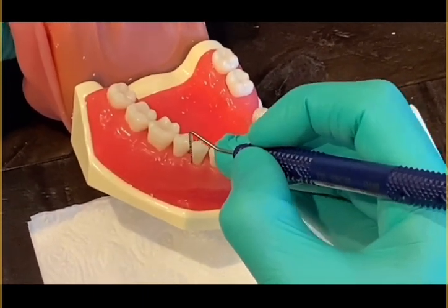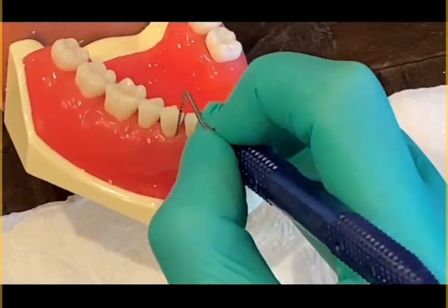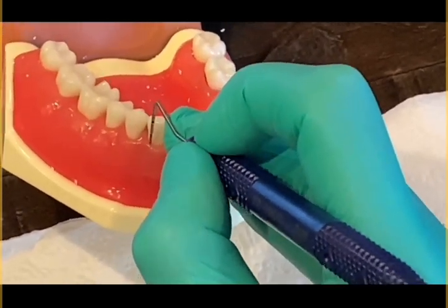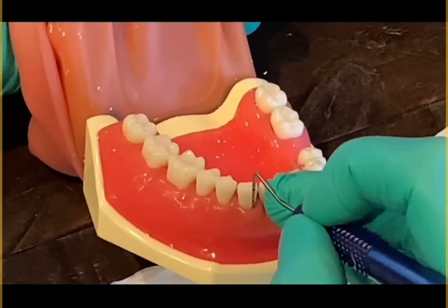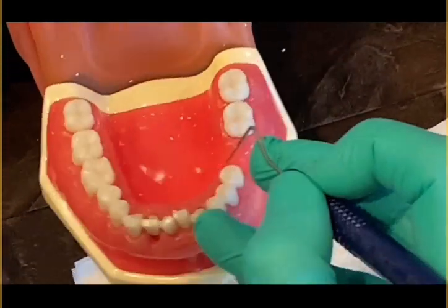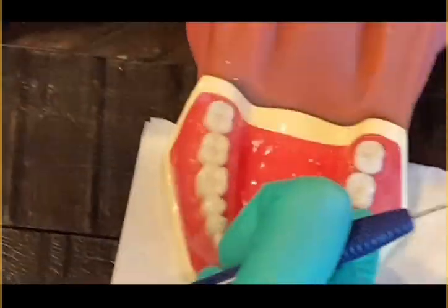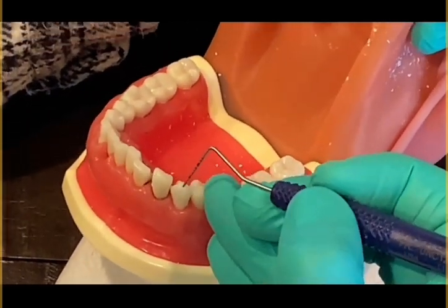4, 3, 4, 4, 3, 4. Coming around, I did all the anteriors. I am now on number 22, and I'll do 21.